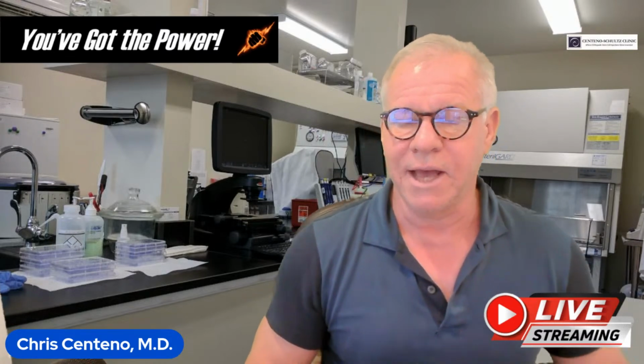Again, if you're just joining us, we're going to be talking about what imaging metrics determine CCI in my book, simply because I get a lot of patients who have been told they have CCI. And then I look at all the different measurements, we review it on a telemedicine, and it doesn't really seem to me that their measurements actually qualify them as having craniocervical instability. So as you might imagine, they're confused, they're not happy, etc. So let's get into this. And after this, I'll take questions, and we will go from there. Here, let me share my screen.